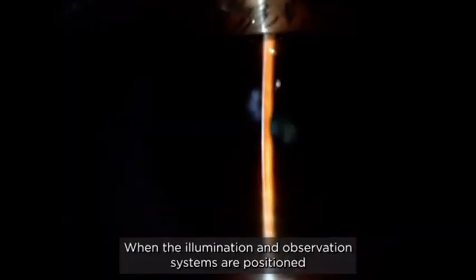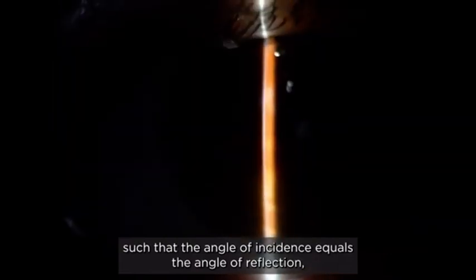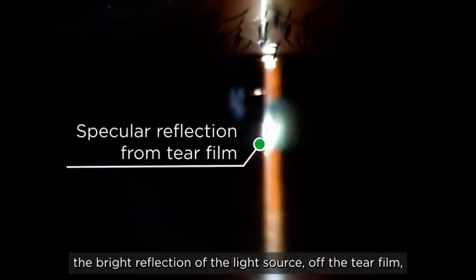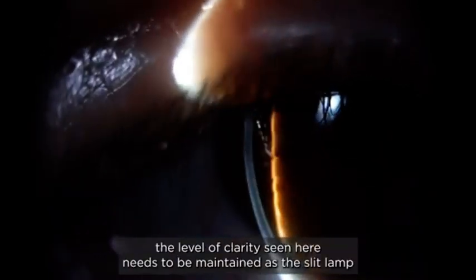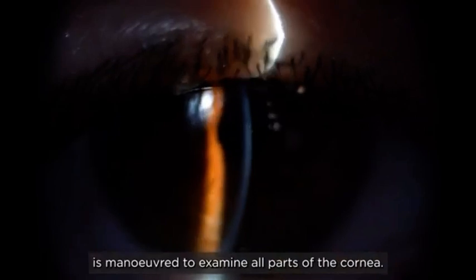When the illumination and observation systems are positioned such that the angle of incidence equals the angle of reflection, the bright reflection of the light source off the tear film is seen on the front of the optic section. To be clinically useful, the level of clarity seen here needs to be maintained as the slit lamp is maneuvered to examine all parts of the cornea.